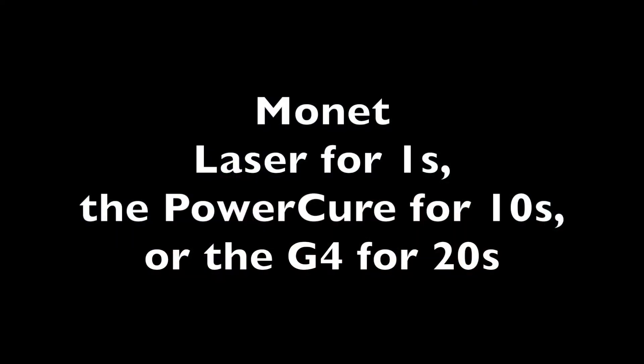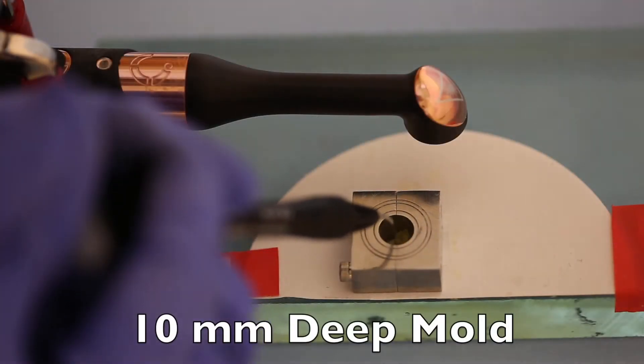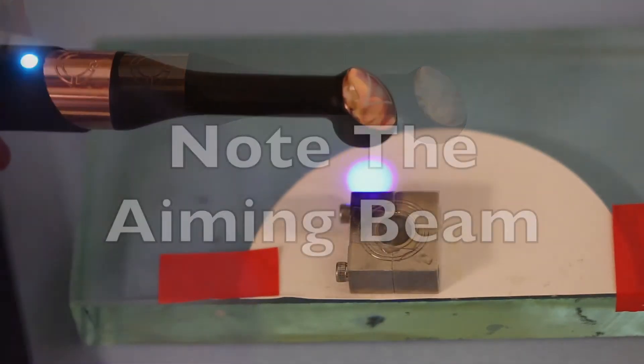We use the Power Cure for 10 seconds and the G4 for 20 seconds. The mold was 10mm deep, and here we can see filling the mold. Note the aiming beam on the Monet.